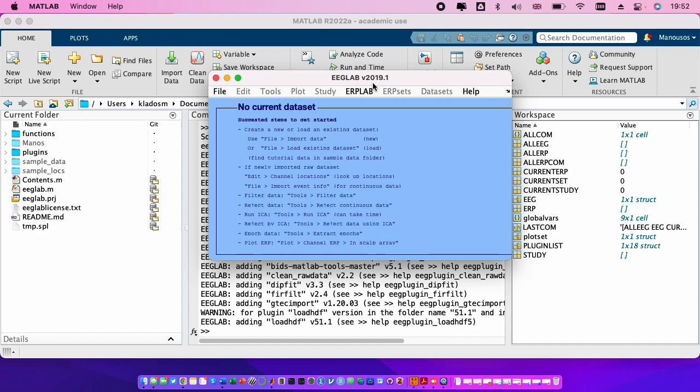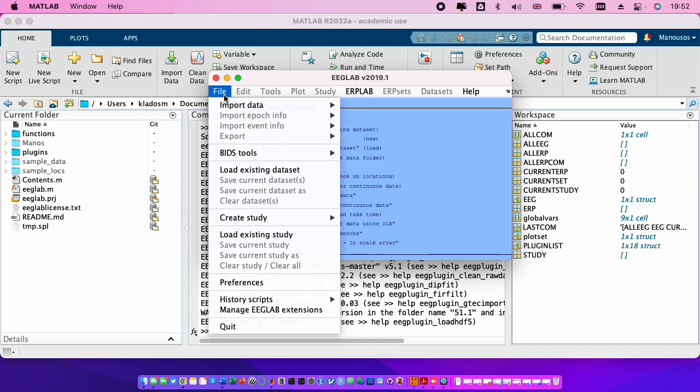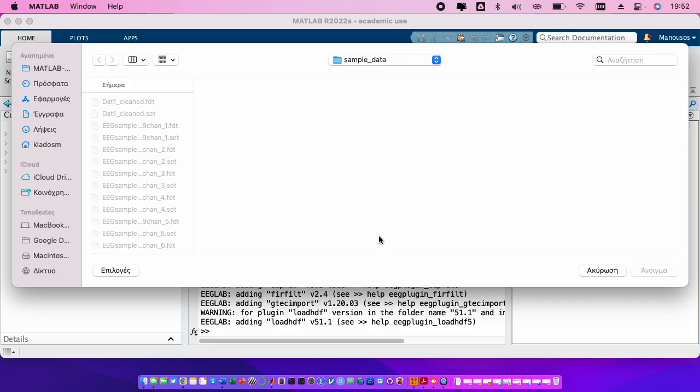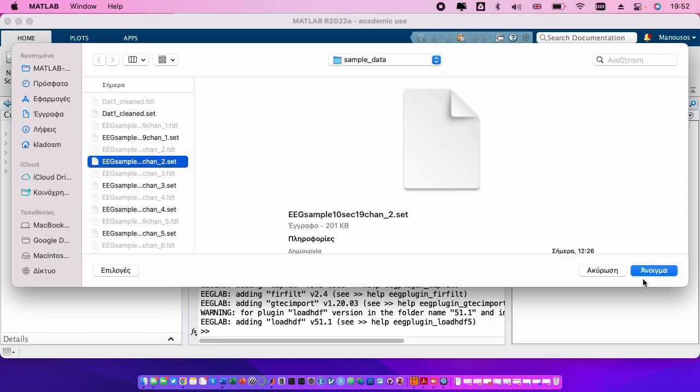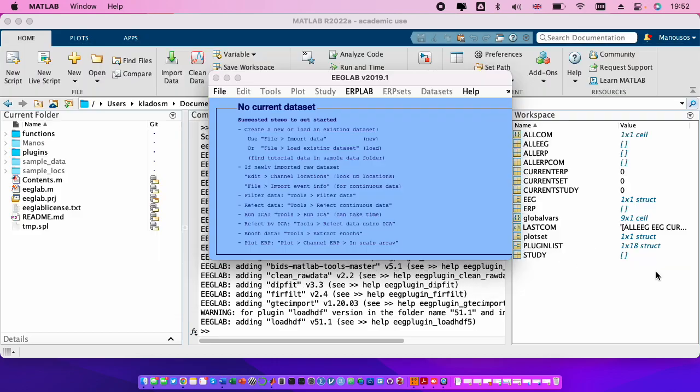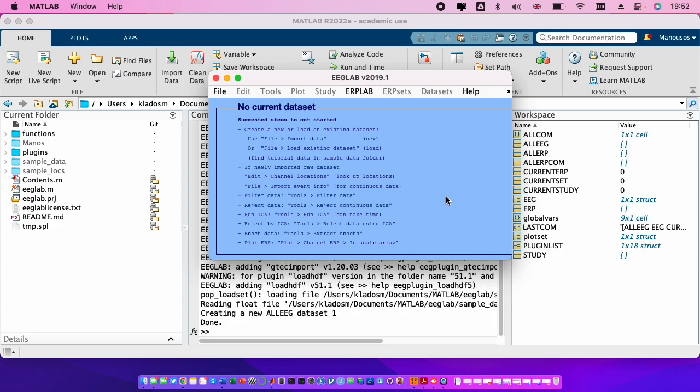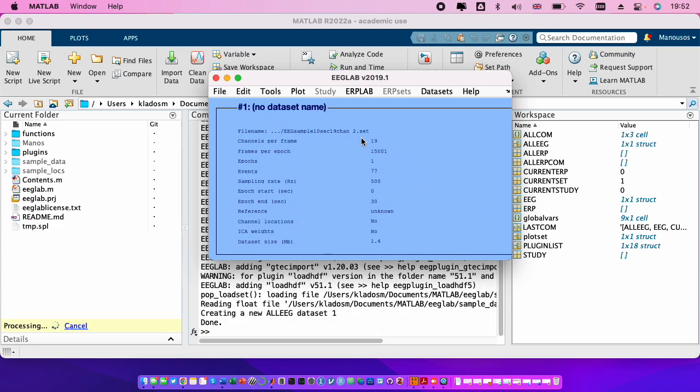Then let's load some simple data. We go to file, load existing data set. We take for example this one, the second, we press open.